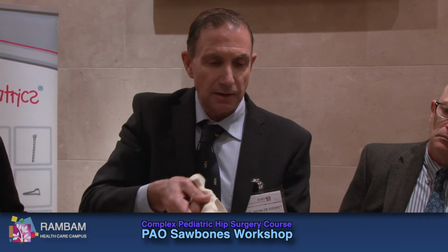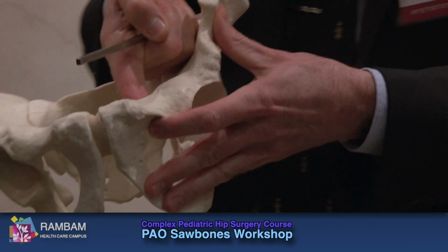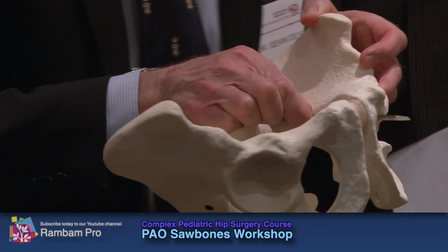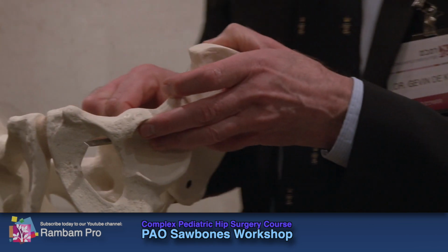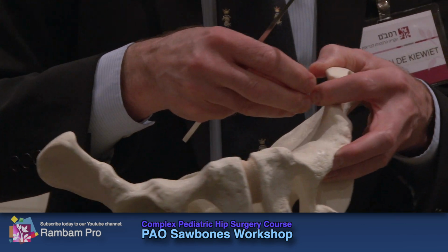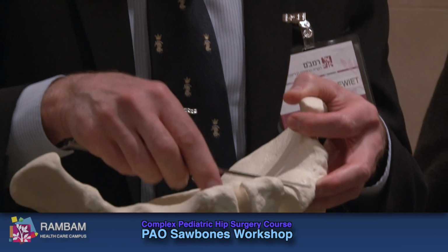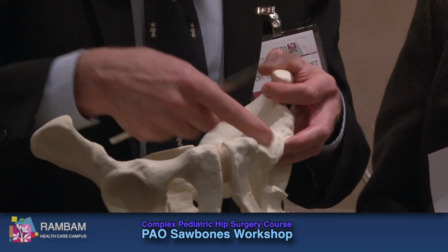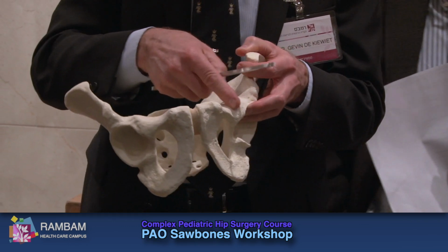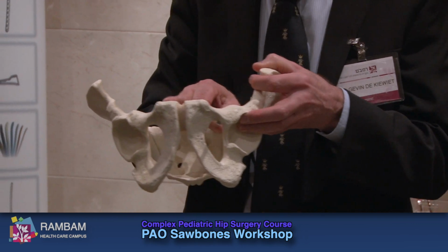And remember that your retractors are going around the pubic ramus like this. The reason for that is because the obturator nerve and vessel are coming just there. If you really want to be safe, you go really far medial. If you go too far medial, osteotomy rule 2, translation. Right? A big amount of translation, you get non-union. It can be prominent here, it can affect the iliopsoas function, you get a prominent iliopsoas afterwards, that's difficult to come back from. So you want to be as close to the acetabulum as possible. The closer you are, the better the rotation, but beware of the obturator nerve here.